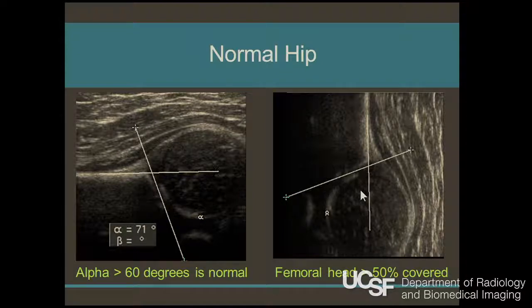The tricky thing, again, with this case, we just had one the other day where I had to bring the patient back to re-image him. You can easily make this angle look abnormal, but you can't make it look normal if it is abnormal. So if you're getting 50, 52, 54, and then you get one that's 62, it's 62. Because you can slide off on these things in weird angles and make it look really shallow when it's not.